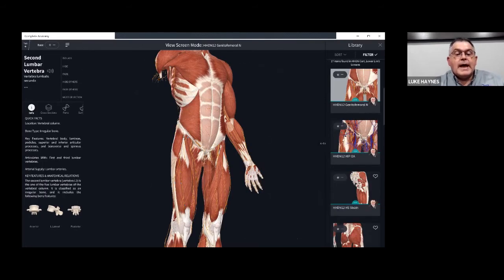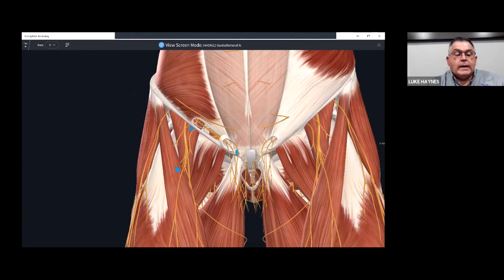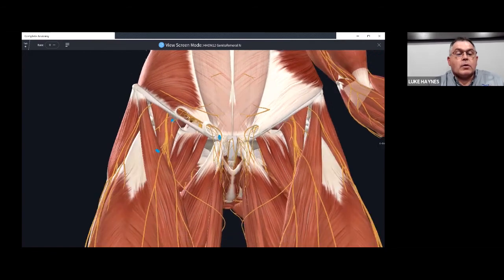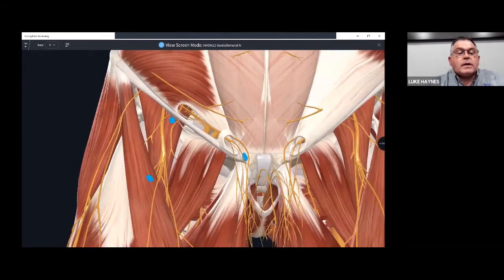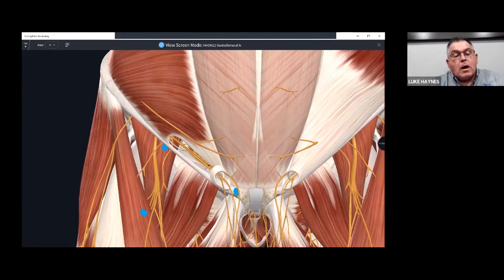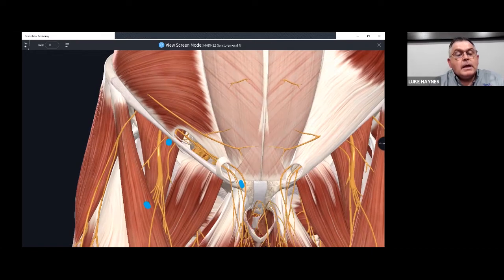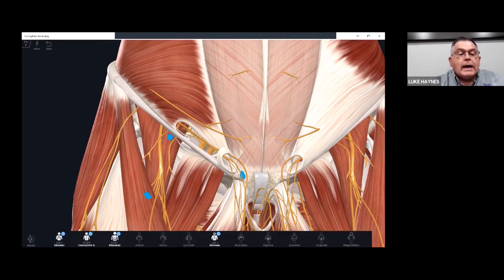So into our 3D anatomy, we will be the different locations here. And this is represented slightly differently than the previous picture. Femoral artery sitting right in this area. We're going to be 1 finger breadth lateral to that. And then you can see, let me highlight.